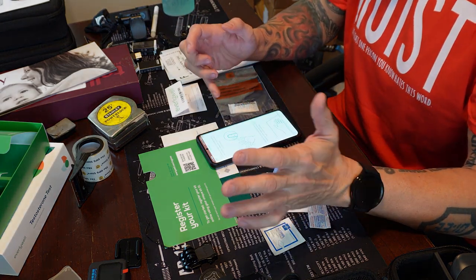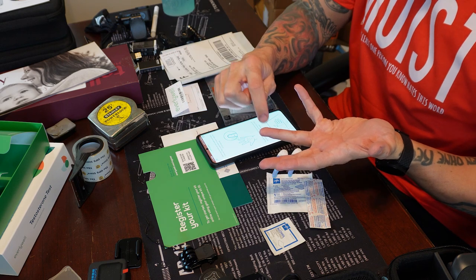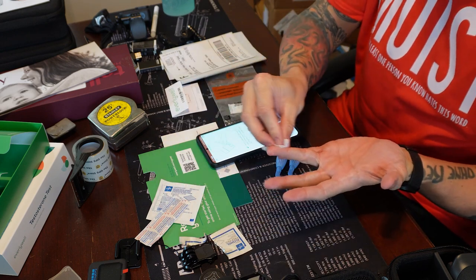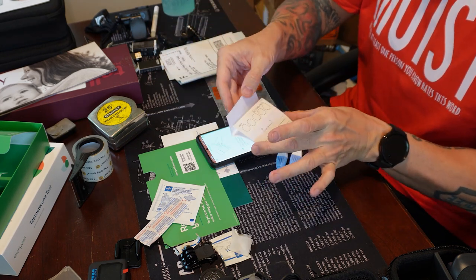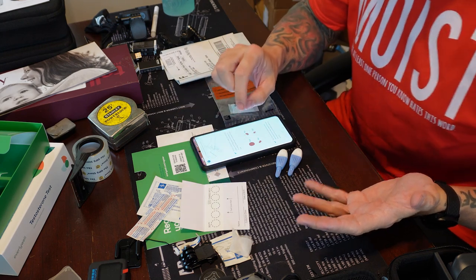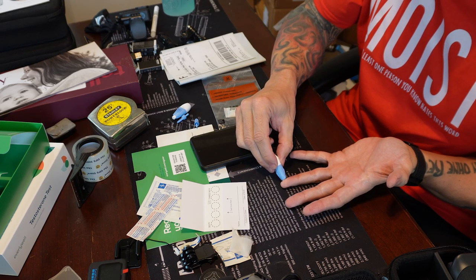It wants you to now pick the best finger puncture location. It's showing the left hand — I'm going to do that because I'm right-handed. If you're left-handed, you can use your right hand. It shows the fourth finger, not right in the center, but off to the side, and it says you should be laying flat, placed on a firm surface. Pull out the alcohol pad and wipe the area where you're going to be drawing the blood. Take the collection card — this particular one has five bubbles — and as it says in the phone app, you want to bleed until you cover the full bubbles, not partial ones, so they can get a good reading. Lay your finger down, take the lancet cap off, put it down on a firm spot, go off to the side, and just press it until it springs out.